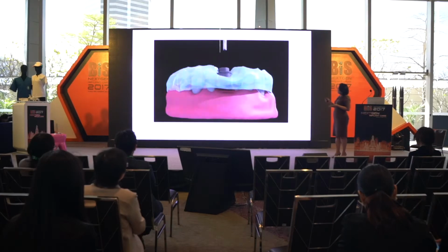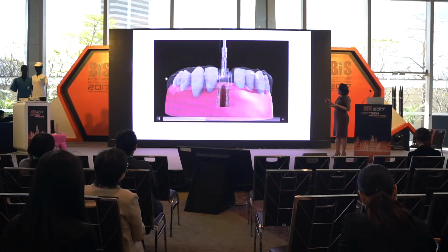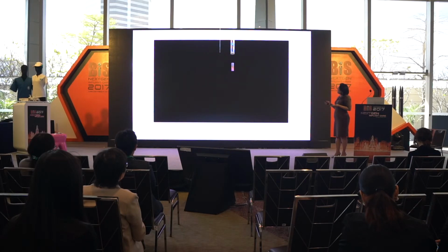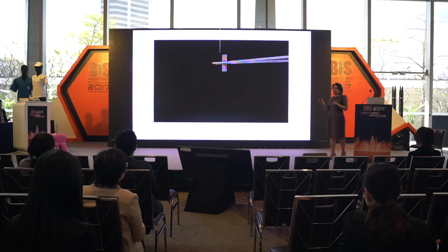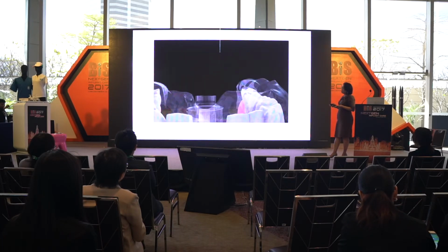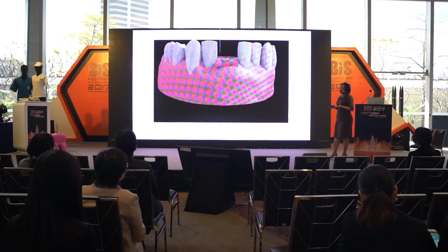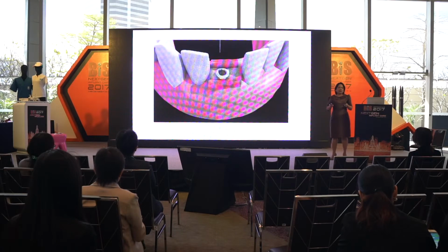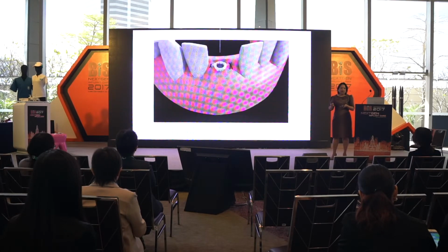After we get the surgical template, we have the room for the osteotomy site for the implant placement. After we place the implant, we can get the bone at the same side of the surgery, and then we use the needle holder to make the bone flatter. After that, we put it back in the surgery site and close the flap. This one is another option for guided surgery and for the bone graft.